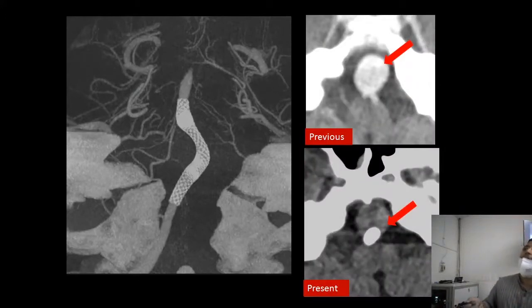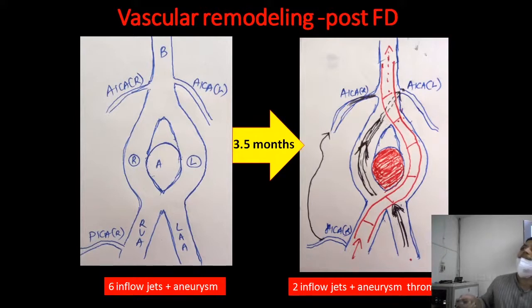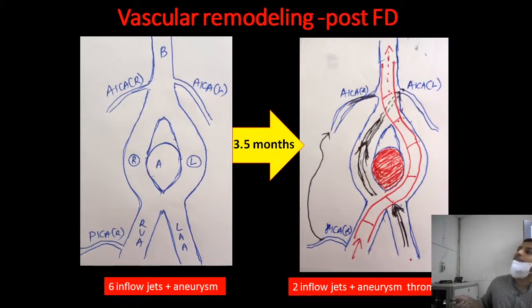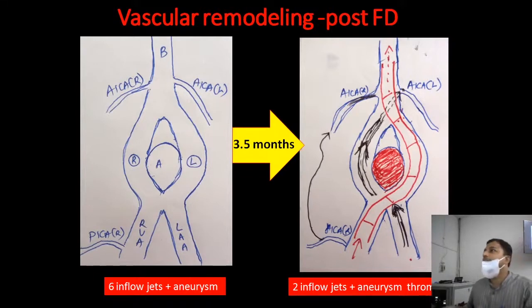DynaCT and axial post-contrast CT images confirmed that the previously brightly filling aneurysm is now completely excluded from the circulation. The vascular remodeling was remarkable: flow from the right vertebral artery now traverses through the left limb into the basilar artery, while from the left vertebral artery only the right limb and AICA are filling. We successfully converted 6 inflow jets into 2 inflow jets, with complete aneurysm thrombosis — a result beyond our expectations.